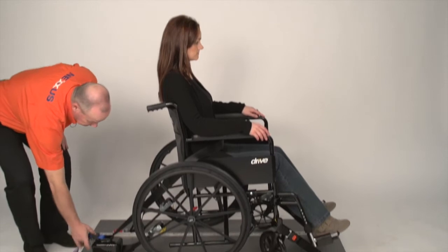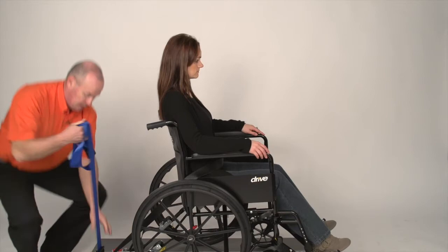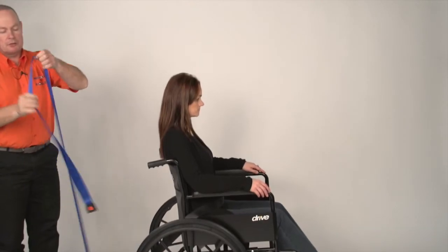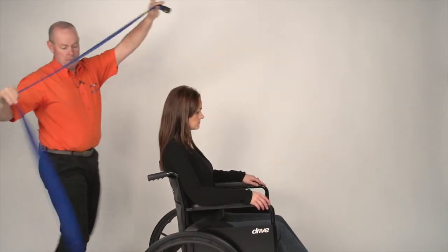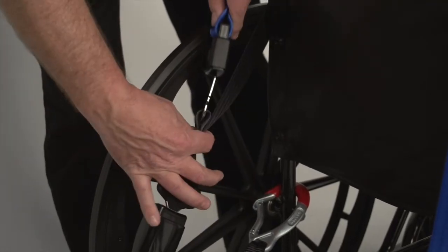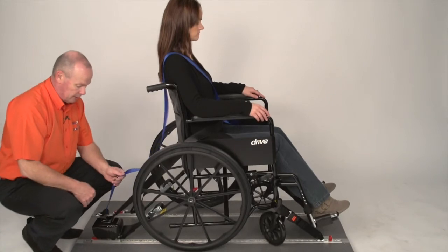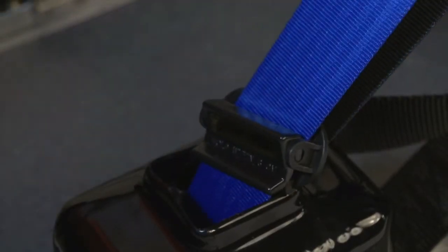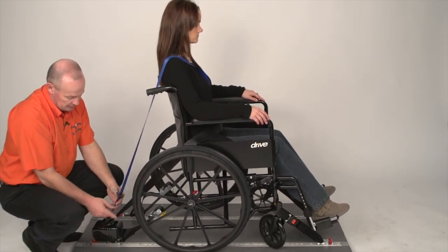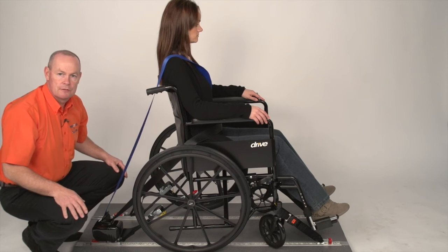Come to the rear, take all of the blue webbing out of the reel, and squeeze the top of the clunk clip together to lock it on — this will stop the webbing retracting back into the reel. Take hold of the webbing, place it over the shoulder of the person, underneath the armrest again and back into the lap belt. There is no tension on this belt at present. Take hold of the webbing, hold it tight, and release the clunk clip, letting the webbing retract back into the reel. For comfort, take hold of the webbing, lift it a little bit out of the reel, squeeze the clunk clip back in, taking the tension just off the shoulder.